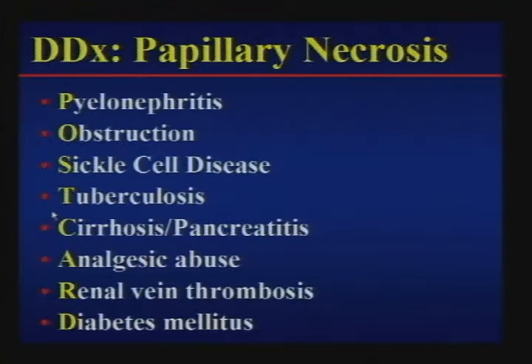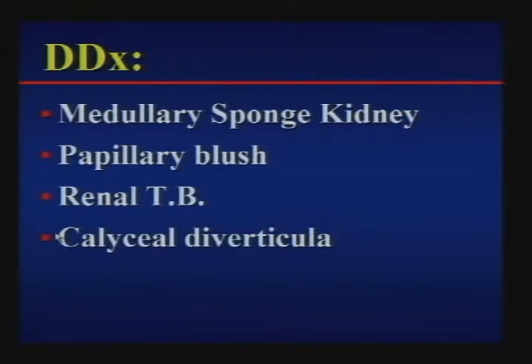You're going to kind of go, tumor, neoplasm, infection. You'll say things over, but other things to consider that don't exactly look like this, but renal TB is something, if it just involves a single calyx and it looks rather distorted, is something you need to exclude. Remember that calyceal diverticula arise from the fornices and not from the central portion of the collecting system.